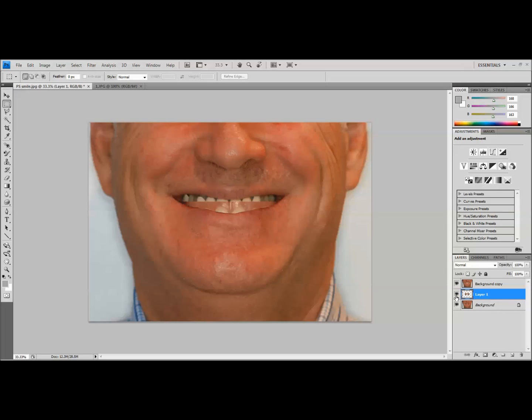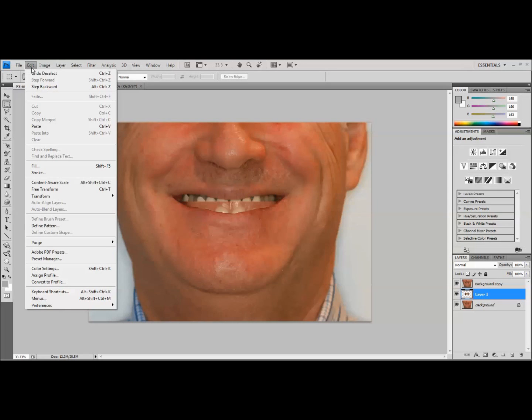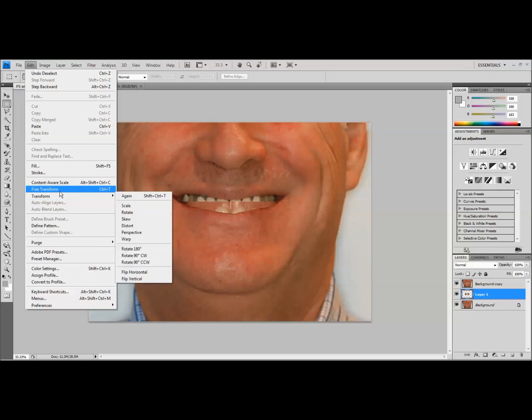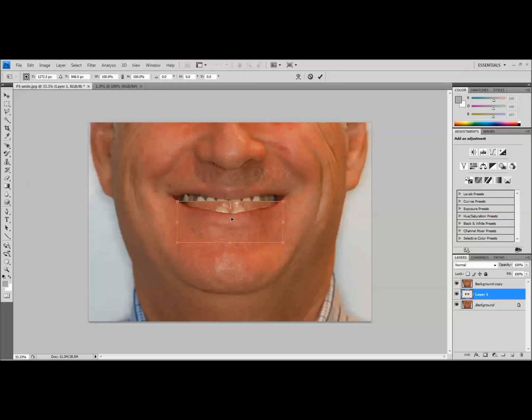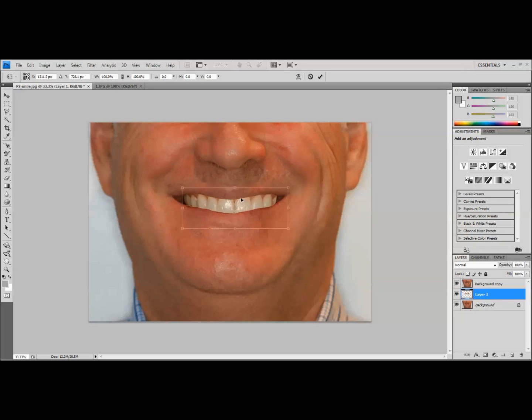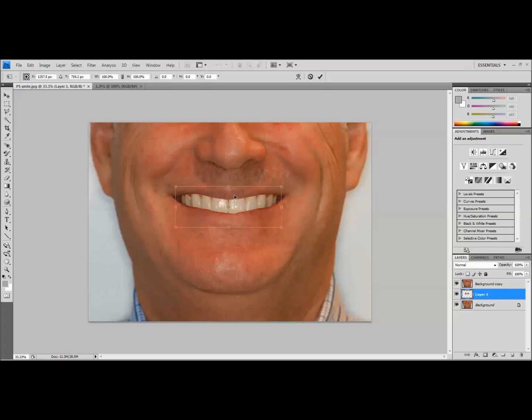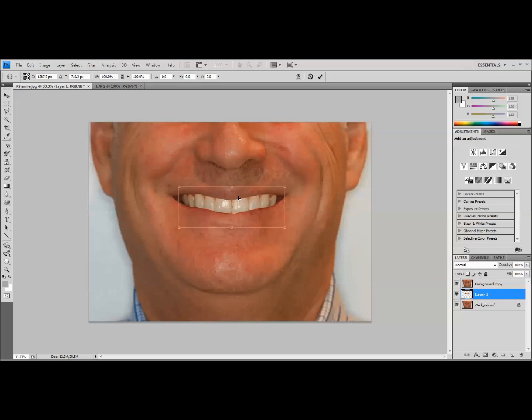So we're going to turn all of our layers on where they're visible, and we're going to highlight the layer that has the actual simulated teeth. Come to edit, free transform, and that's going to allow us to move this around. And as you can see here, I'm moving this around within the smile. What I'd like to do is get the incisal edges roughly following the lip line, and you can see that already looks really nice. If you were just trying to do a simulation to start the conversation about cosmetics, this may be all you need to do.